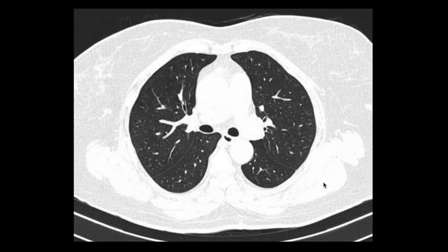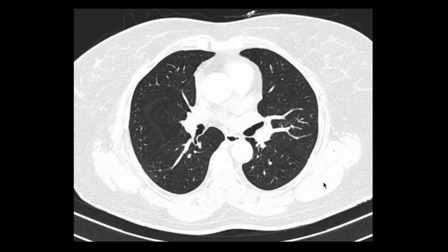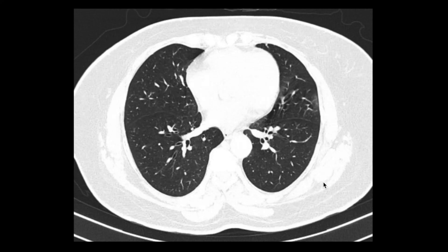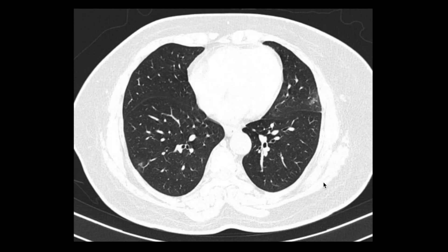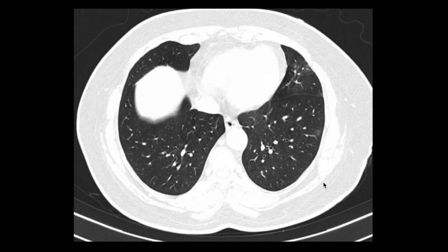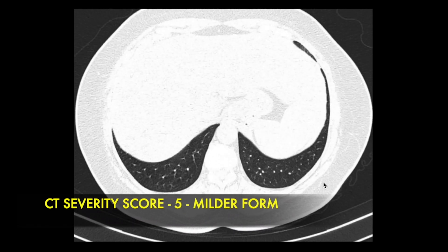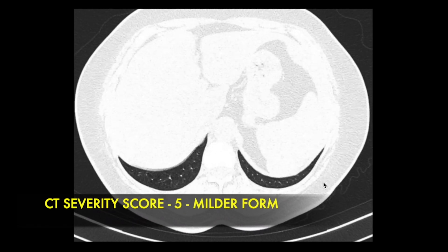This is another RT-PCR positive patient demonstrating ground glass opacities in the peripheral region. A total of 5 segmental regions showed ground glass opacities with less than 50% involvement of parenchyma, and thus a CT severity score of 5 is given for this case, which is a milder form.